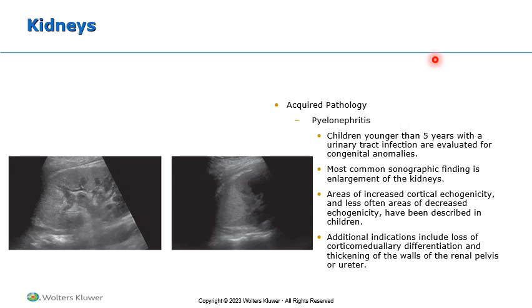If it's early on, it might be the thickening or the hypoechoic appearance because of edema. If it's later, after the patient has had this chronically for a longer period of time, it could be because of fibrosis or atrophy of the cortex. So the variation in appearance really is just a piece of the overall clinical picture on this.